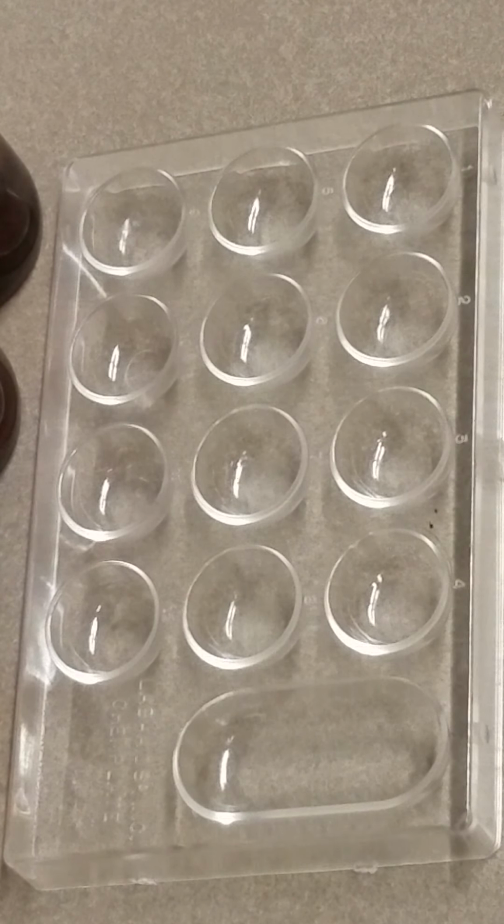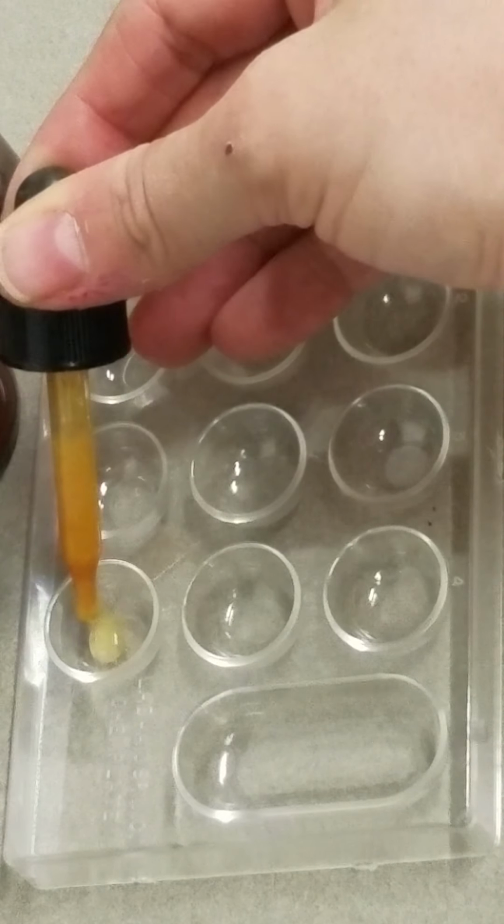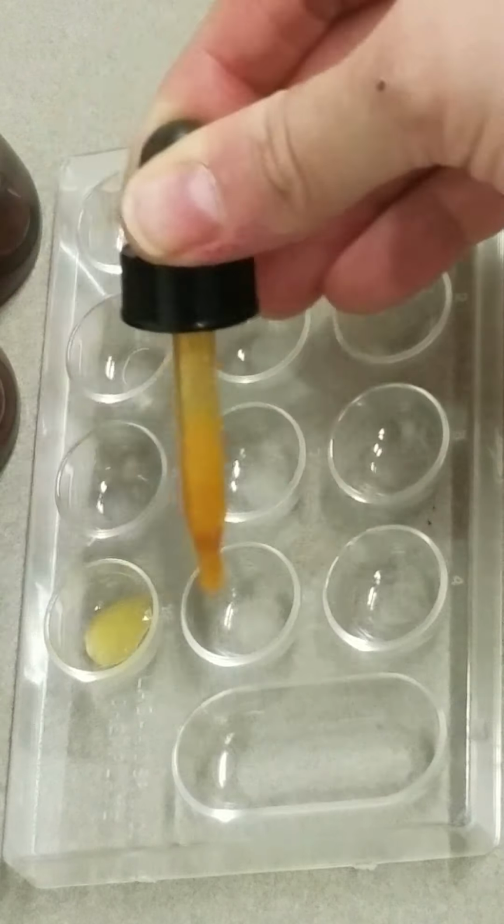I have a clean well plate here, and I'm going to add a couple of drops of my simulated A positive blood in 3 different wells. Then I have my anti-A that I'll add in the first well, and you see we get a reaction, so that indicates that the blood type is positive for A antigens.